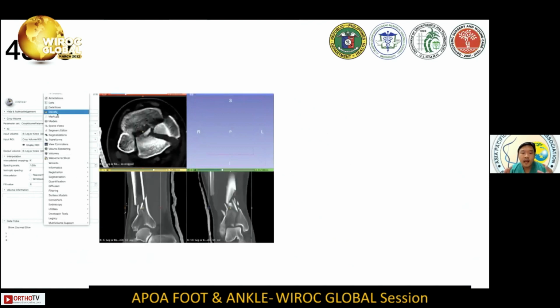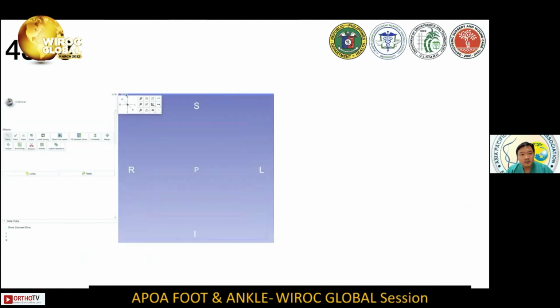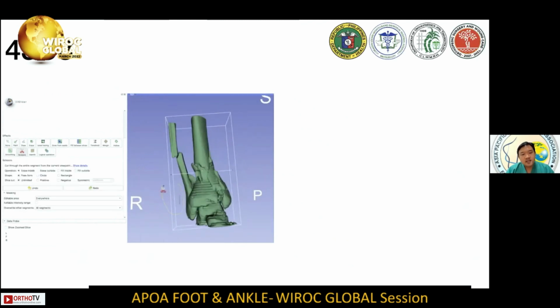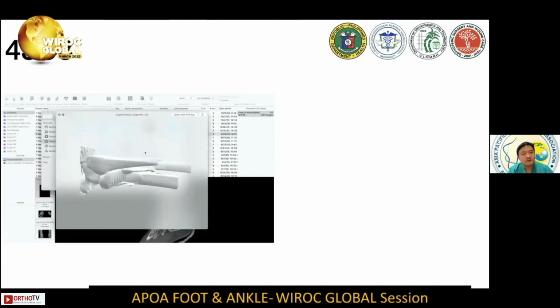And we want to narrow it down simply because the bigger it is, the more time it will take to print out. And now we're cleaning off the splint, we're trimming off the edges, we're removing fine comminution so that we don't have to print the unnecessary portions in this file. And we export this as an STL stereolithography file. All of this can be done in a matter of 10 minutes.